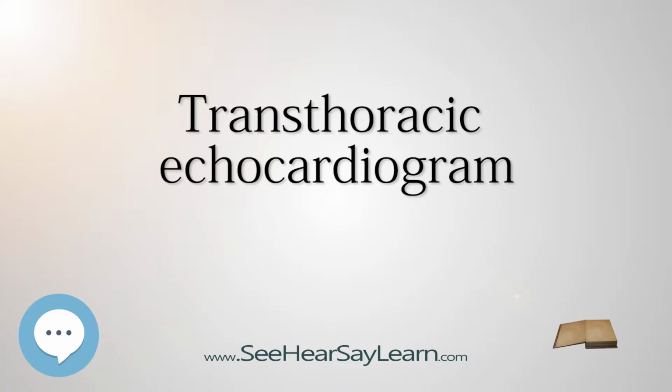Details. An echocardiogram can be used to evaluate all four chambers of the heart. It can determine the strength of the heart, the condition of the heart valves, the lining of the heart, the endocardium, and the aorta. It can be used to detect a heart attack, enlargement or hypertrophy of the heart and infiltration of the heart from an abnormal substance. Weakness of the heart, cardiac tumors, and a variety of other findings can be diagnosed with an echocardiogram.